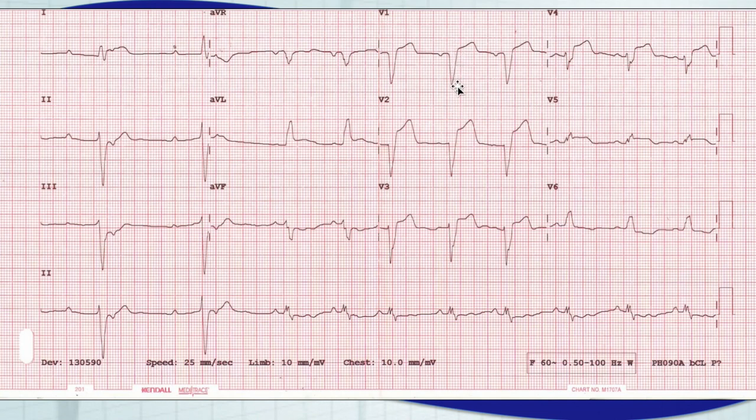It's predominantly a negative QRS complex, especially the terminal wave. In fact, it's an entirely one QS wave, which is very pathognomonic of a left bundle. And then if you look at V6, you do have a monophasic R wave. You can't really count lead 1 because remember the rhythm changed. All right, so looking at V1 and V6, we currently have a sinus rhythm, a sinus arrhythmia to be more specific, with a left bundle branch block.